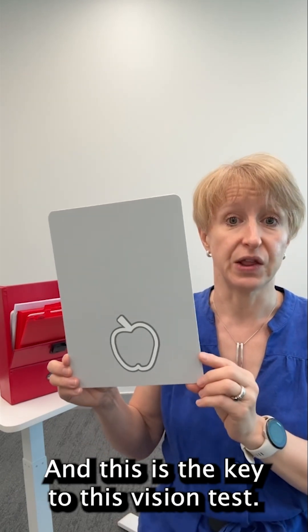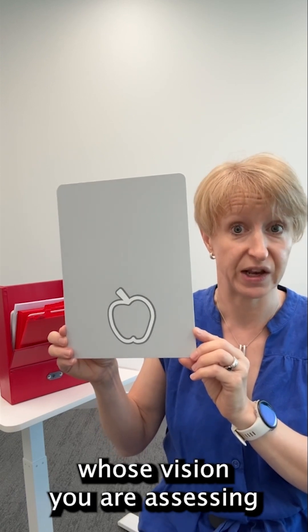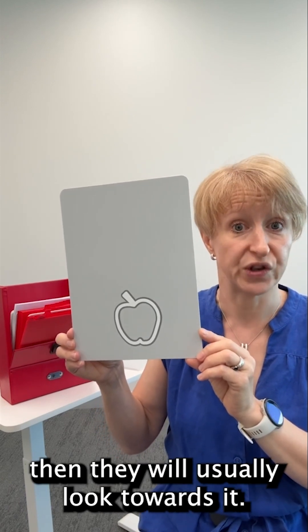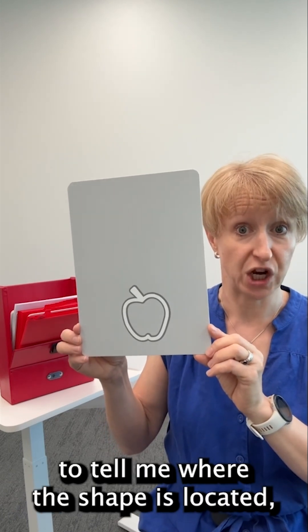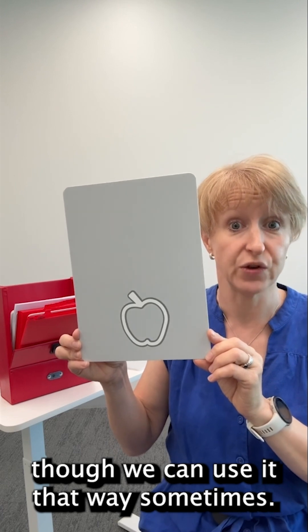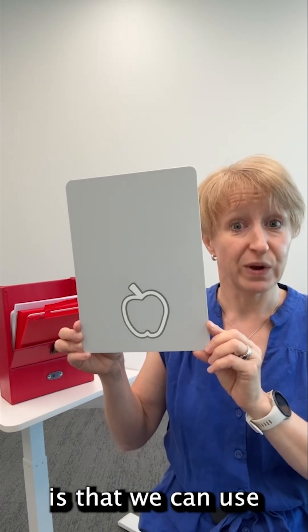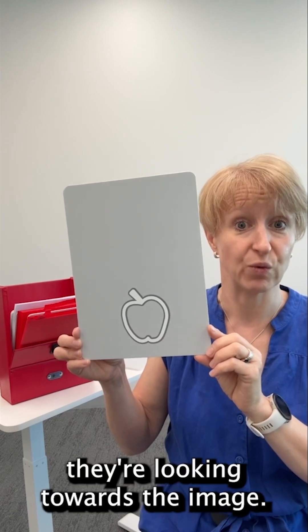And this is the key to this vision test. If the child or adult whose vision you are assessing can see the picture, then they will usually look towards it. For this test I don't need the person I'm testing to tell me where the shape is located, though we can use it that way sometimes. But what makes it such a great test is that we can use the person's eye gaze to judge whether or not they're looking towards the image.